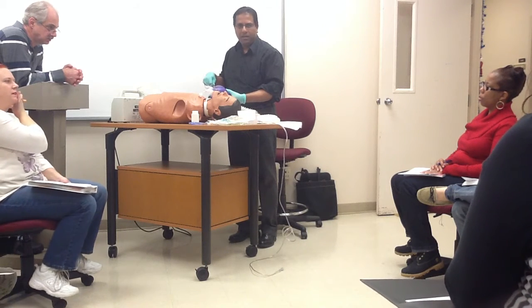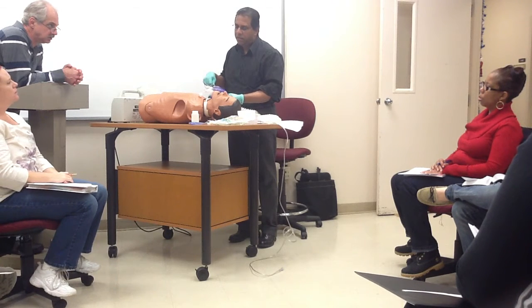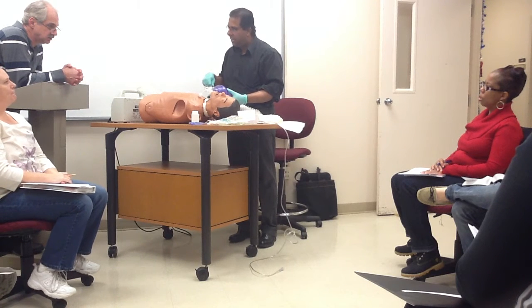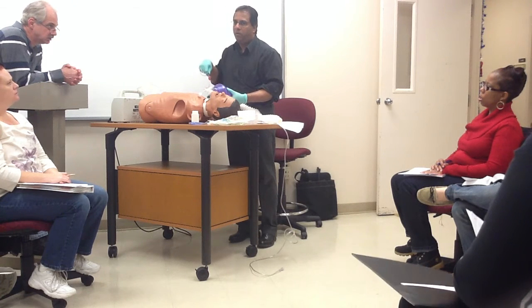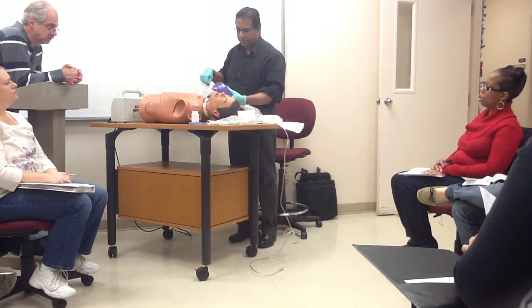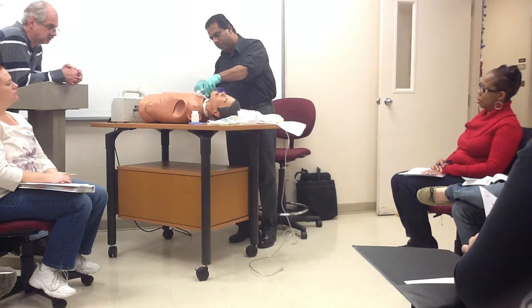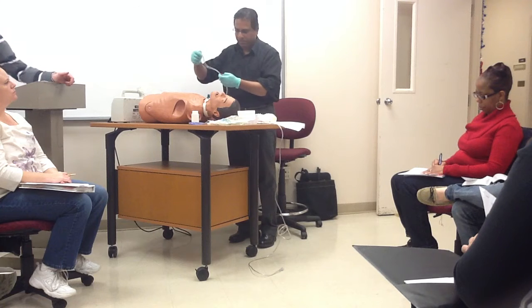Okay, what you need to do is, you can tell them, take a breath, breathe. You coach them if they can understand you. Or if they can't, if they're unconscious, just breathe with them. Don't fight against them, okay? All right, you bag them. Now, you're going to take him off. I don't think the catheter will go down, but we'll see.